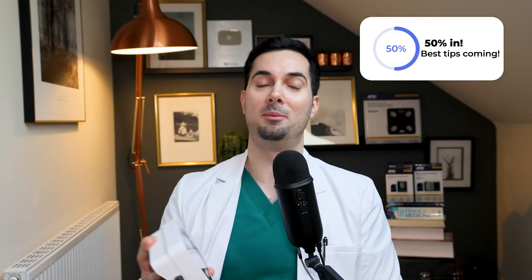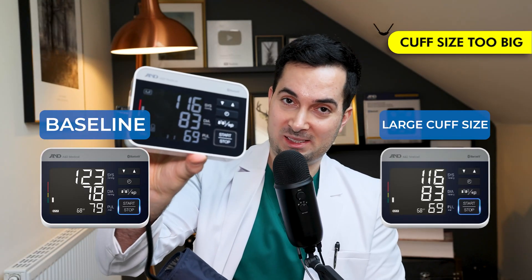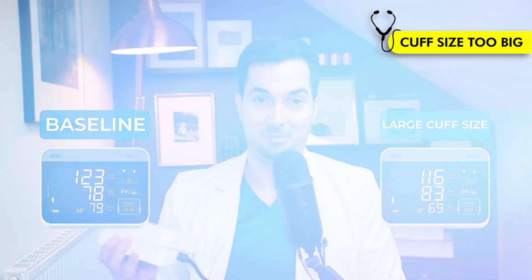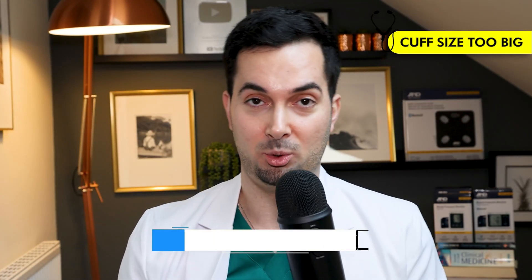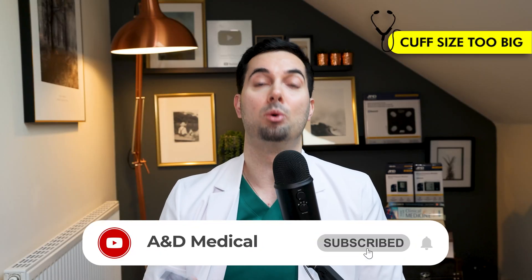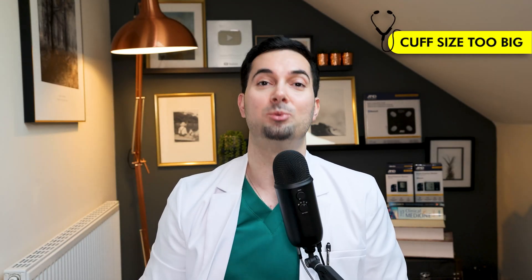Wow — the blood pressure cuff that's too big is going to give us a lower reading. Remember, baseline was 123/78 mmHg. The large cuff size gave a blood pressure of 116 over 83 — 116/83. It has underestimated my blood pressure because the cuff was too big for my arm. Make sure you are checking your cuff size. Watch our video on cuff size, how to wear it properly, how to measure your arm — we go through everything in detail on the A&D medical channel.